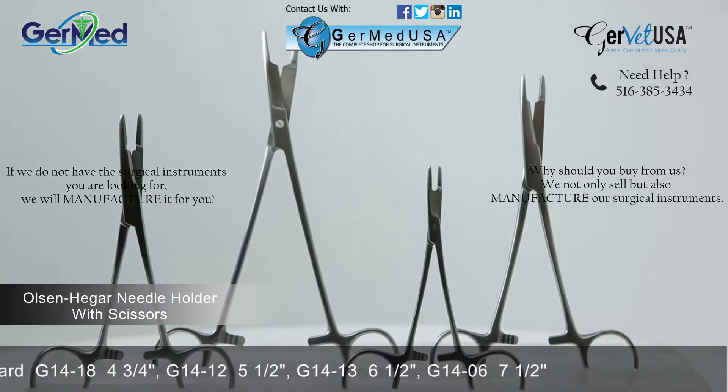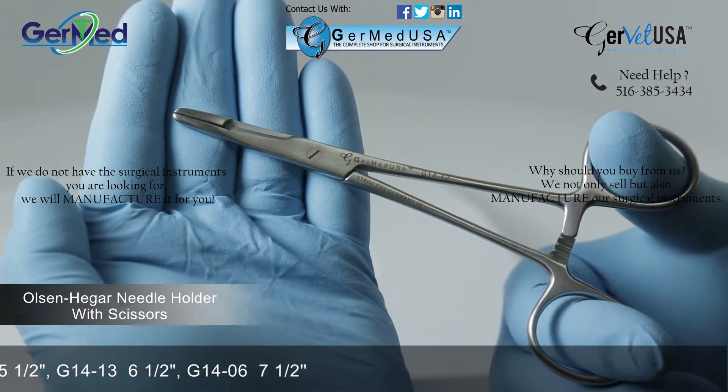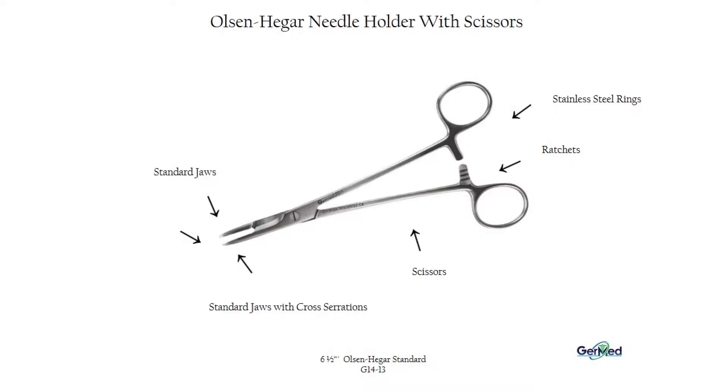They are made available in sizes four and three-quarter, five and a half, six and a half, and seven and a half inches. Standard stainless steel are the most commonly used.